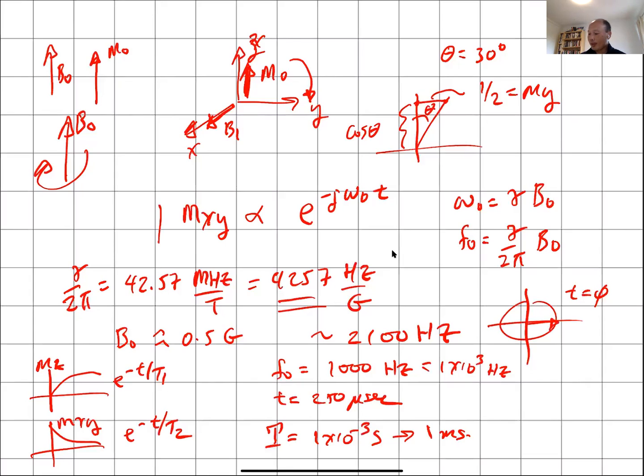And so we go back to here, which we derived last time: the magnetization has this e to the minus j omega naught t dependence. And so as time increases, the angle becomes more negative with that precession. Now this is assuming we haven't applied any additional gradient fields. But even if we do, if you're in the laboratory frame, the net field will always give this negative precession.